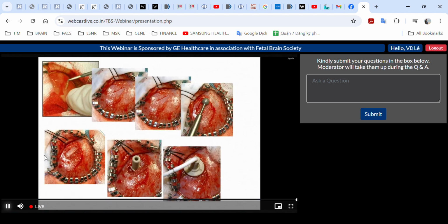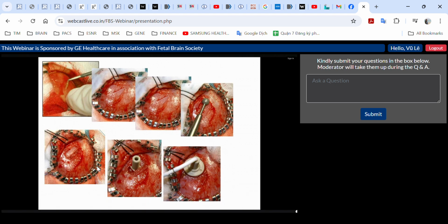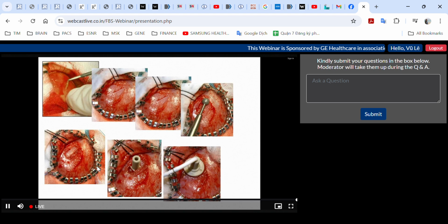The anti-displacement device should be implanted over a bone surface, but the incision and underlying craniectomy must be performed more laterally in newborn infants, given the presence of the anterior fontanelle. The dura mater is gently detached with a dissector, coagulated and incised at the center of the craniectomy.